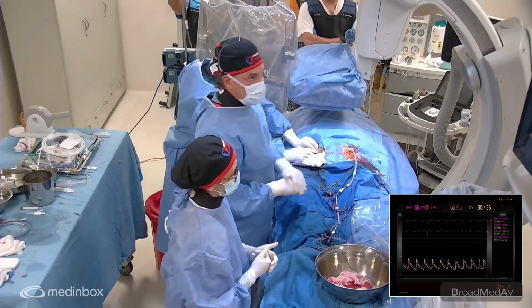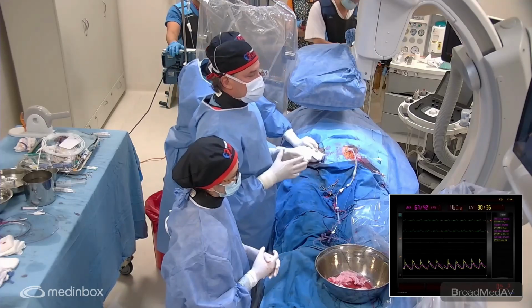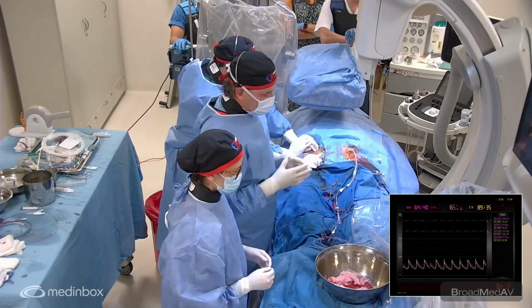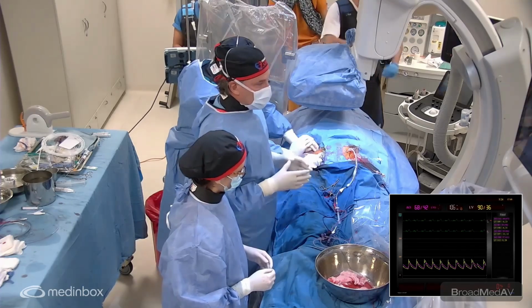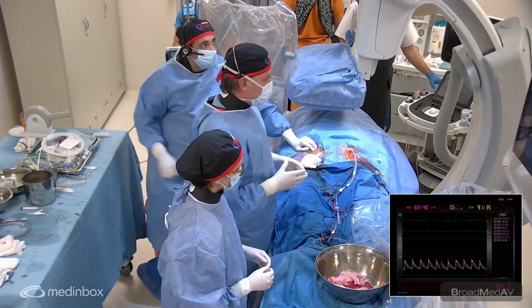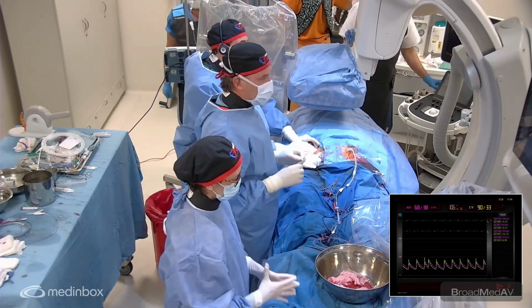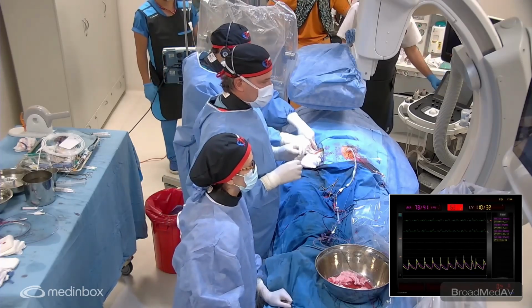And let me give the last 3 or 4 minutes to comment on what we have done in the previous case, just in case somebody was watching and we were rushing because of the time. So what we did in this case, on a young male, we implanted a bifurcated EVAR device, endograft, to treat the abdominal aortic aneurysm. And because this patient has dilated and very short iliac arteries, we have to adapt one strategy.